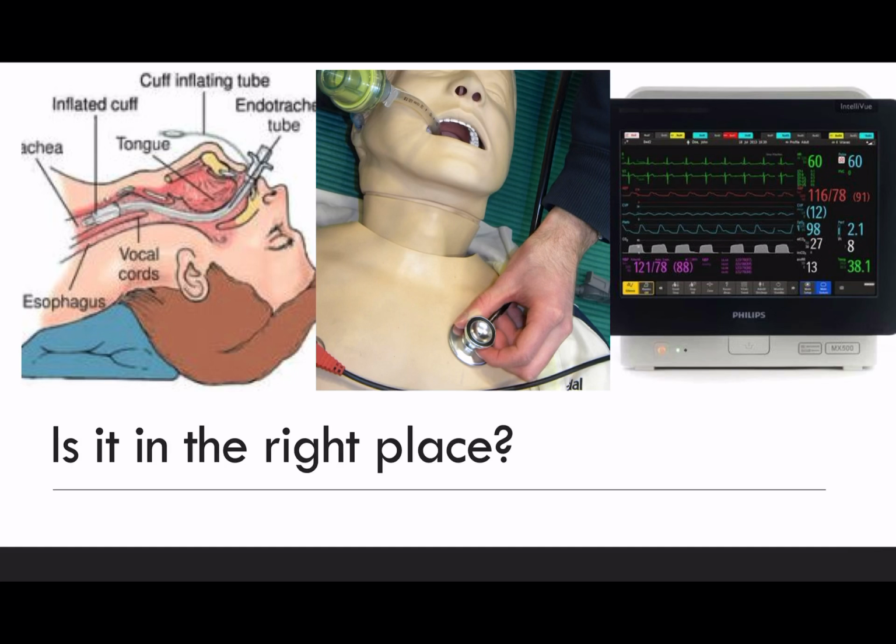However, occasionally, when you move a patient from the trolley onto the intensive care bed, they can dislodge. So it is really important to always be conscious of patients self-extubating and potentially developing an esophageal intubation, especially if they cough as they're being moved, or if they're just coughing naturally. They can cough that tube out and then it can go down into the esophagus.